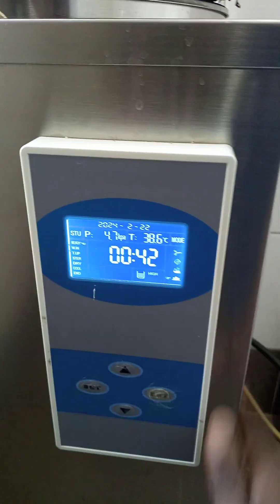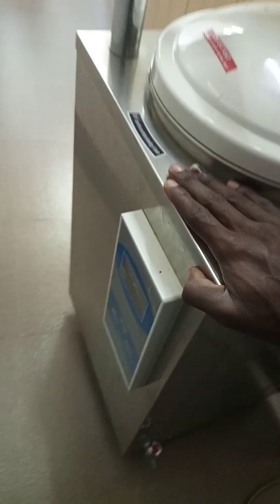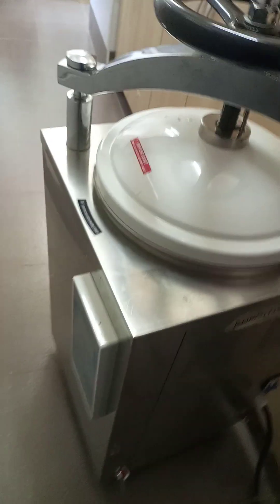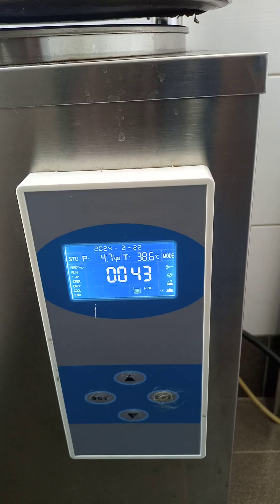Now this is the faulty one. The first fault I had with it was it would switch on fine, show the water level as okay, but when you press ENTER it would just stay there — temperature and pressure would not raise. You can see on the working one that temperature and pressure rise when it's running. When I troubleshot it, I realized the problem was with the heating elements inside. I changed those and that was sorted.